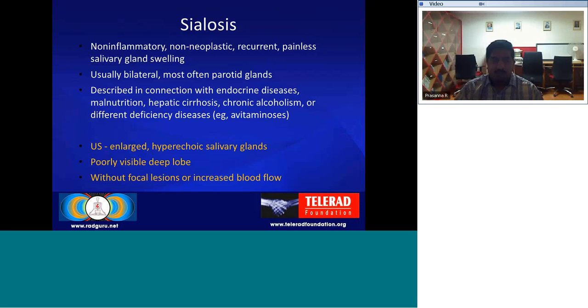Once we give the diagnosis of sialosis, other tests need to be done to rule these out.